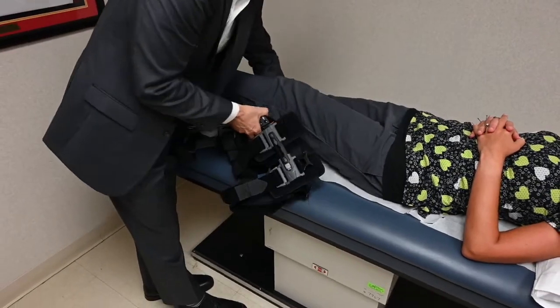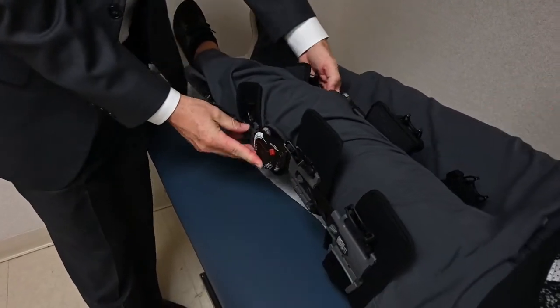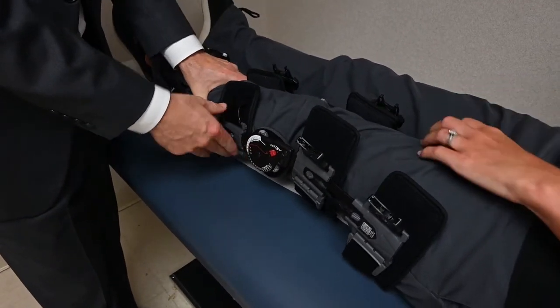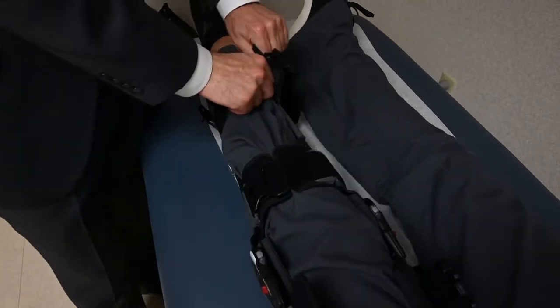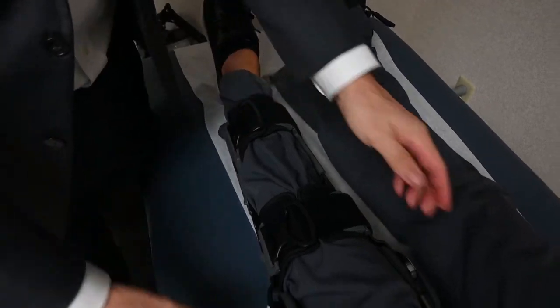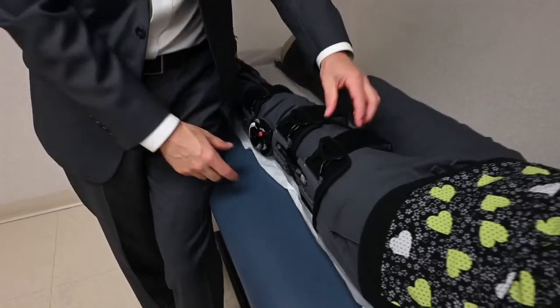The brace hinges are then to line up with that of your knee. We get the hinges at the knee and then we want to make adjustments to the straps. These straps have already been adjusted, so we'll go ahead and clip the straps to apply the knee brace. Once the initial adjustments are made you can simply take the brace off and on by clipping the clips together.